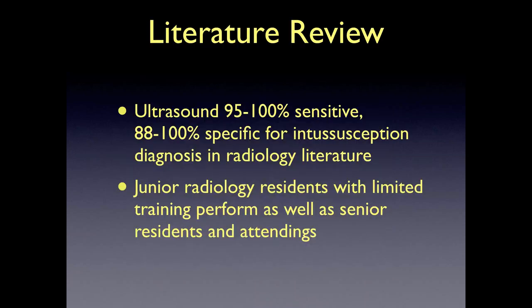In the radiology literature, ultrasound has been found to be 95 to 100% sensitive and 88 to 100% specific for diagnosis of pediatric intussusception. In one of the studies, junior radiology residents with limited training performed as well as senior residents and attendings in identifying intussusception in the pediatric population.